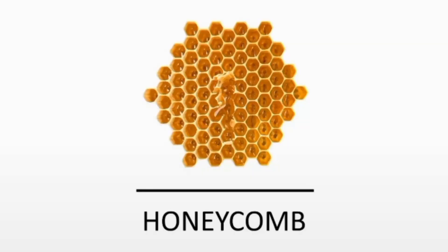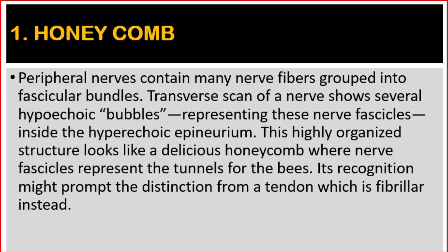Number one: honeycomb. Peripheral nerves contain many nerve fibers grouped into fascicular bundles. Transverse scan of a nerve shows several hypoechoic bubbles representing these nerve fascicles inside the hyperechoic epineurium. This highly organized structure looks like a delicious honeycomb, where nerve fascicles represent the tunnels for the bees. Its recognition might prompt the distinction from a tendon, which is fibrillar instead.